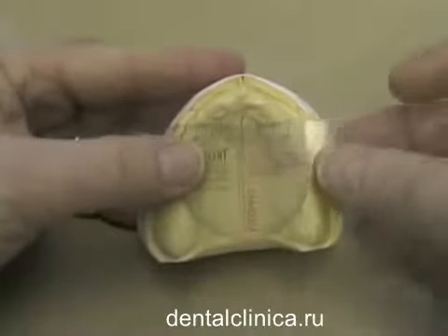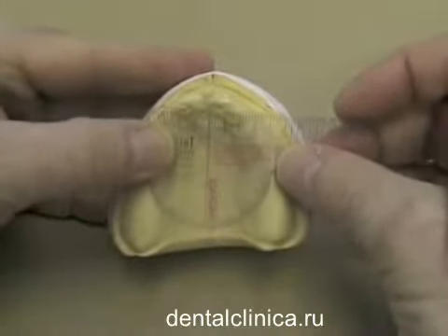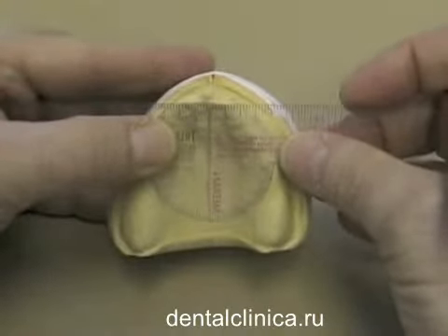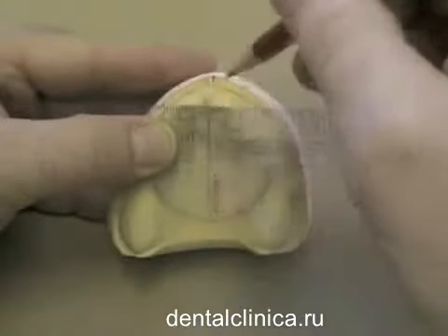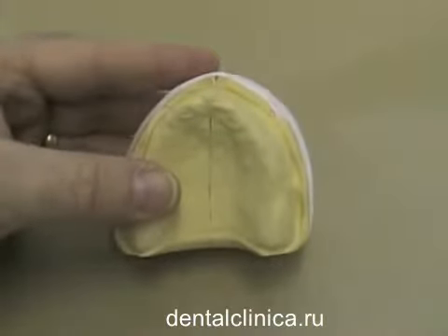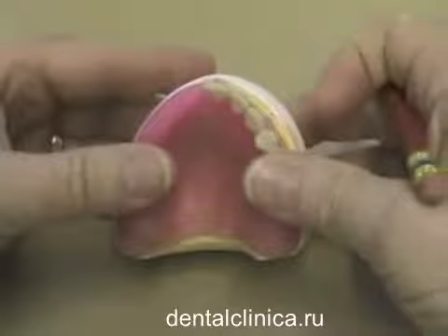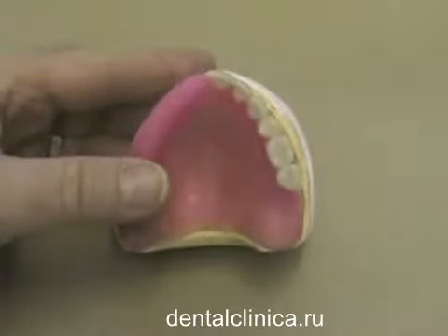We can take our True Bite ruler, line it up along that, bring it up to the distal aspect of the incisive papilla, and again mark those areas out on the land area. And those will be important reference marks for determining whether we set our maxillary canine teeth in their proper position.